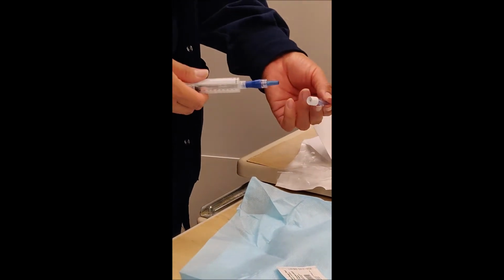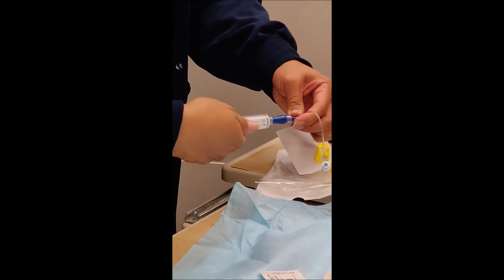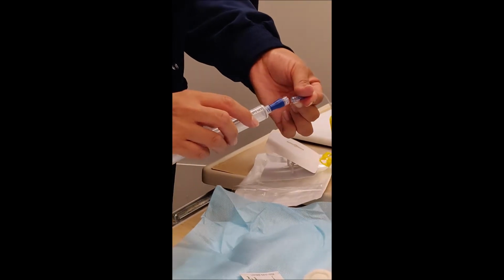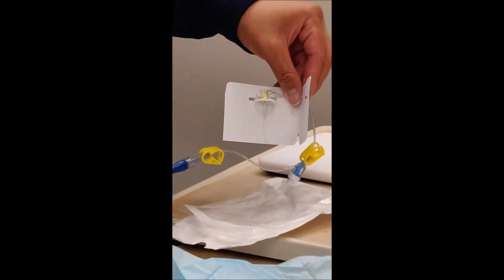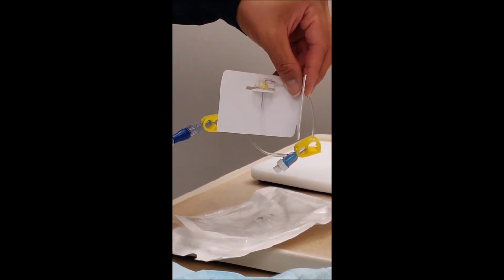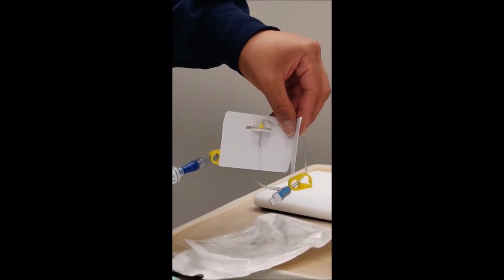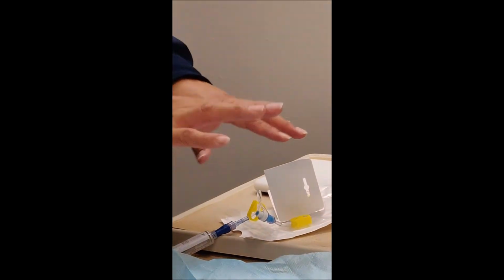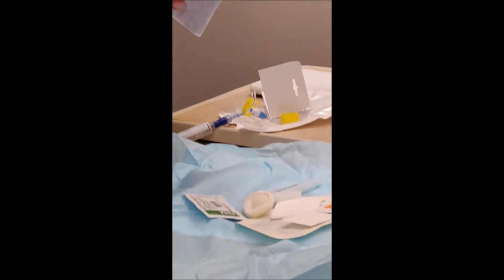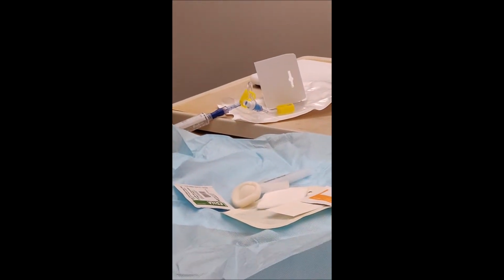And then we're going to access the cap here. Take this part out. We'll be able to flush, and then we're going to gently see the saline drip. Okay, so then that means that we're ready. So when we're ready, we're just going to remove the plastic covering and we're going to go there. So we still have our sterile field. So I'm going to go ahead and don my gloves after I've done the hand sanitizing my hands.